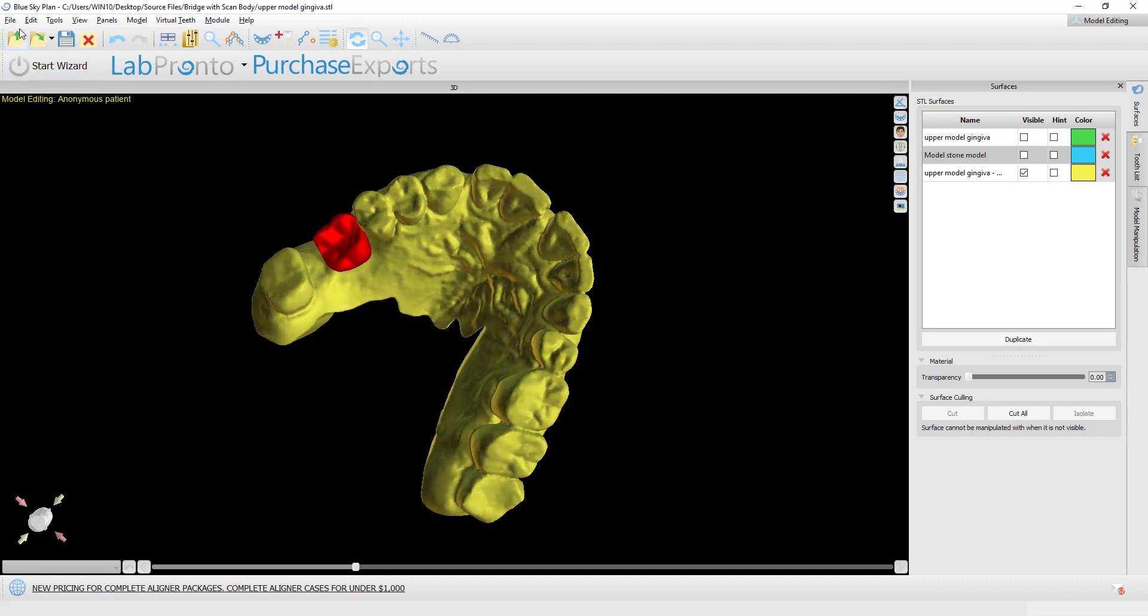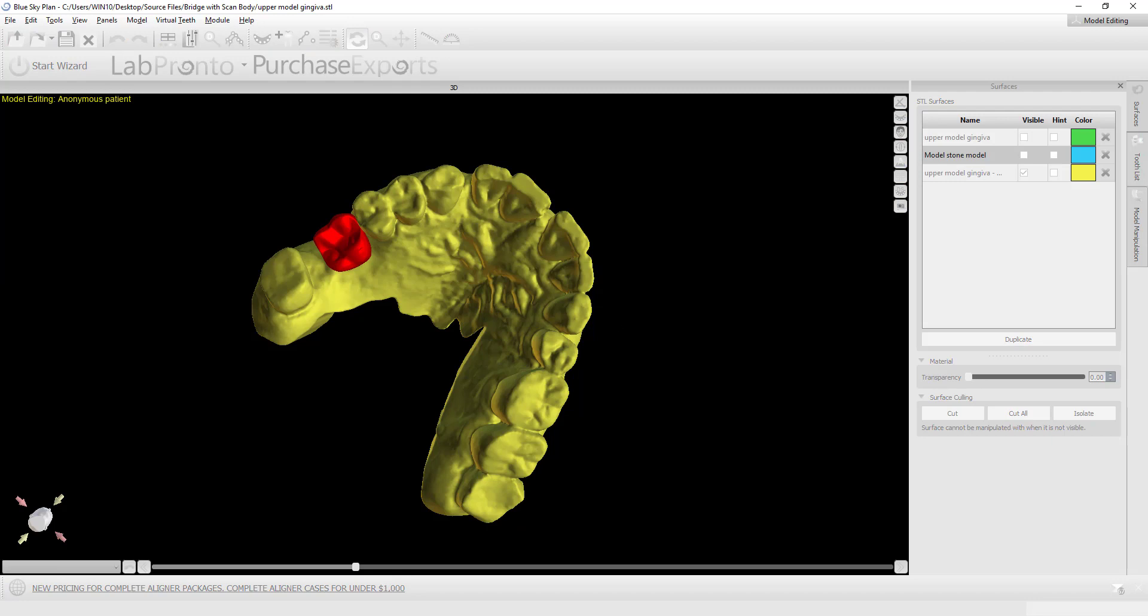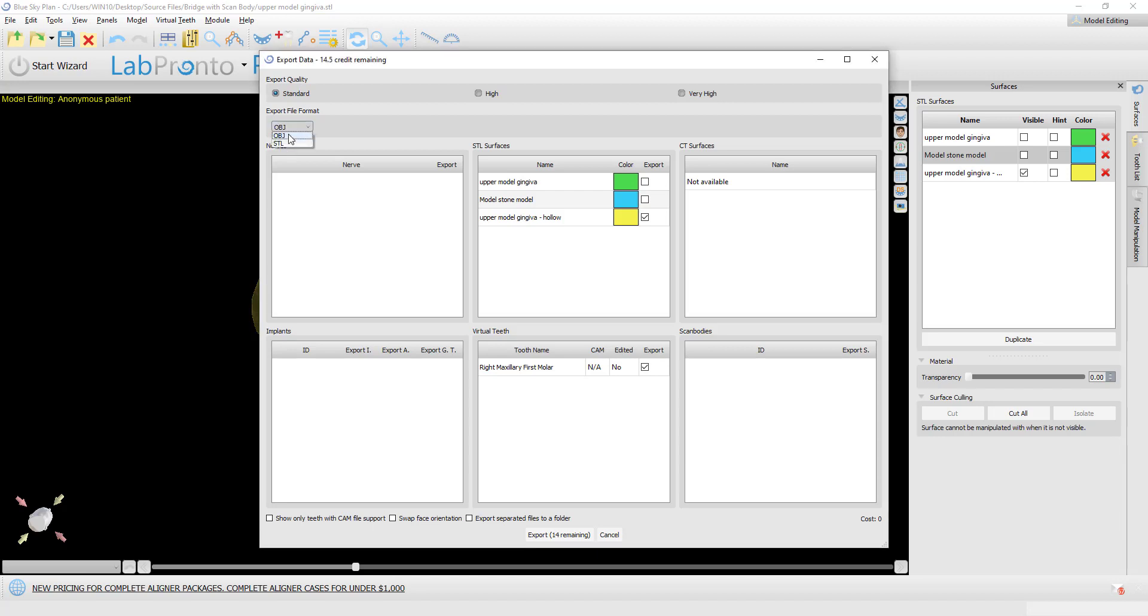Now we're going to go to file export data. We want to make sure that we have the relevant surfaces selected. For our purposes, we have our hollow model or we could just select our solid model if that's what we want. And we also have the tooth that we placed selected as well.